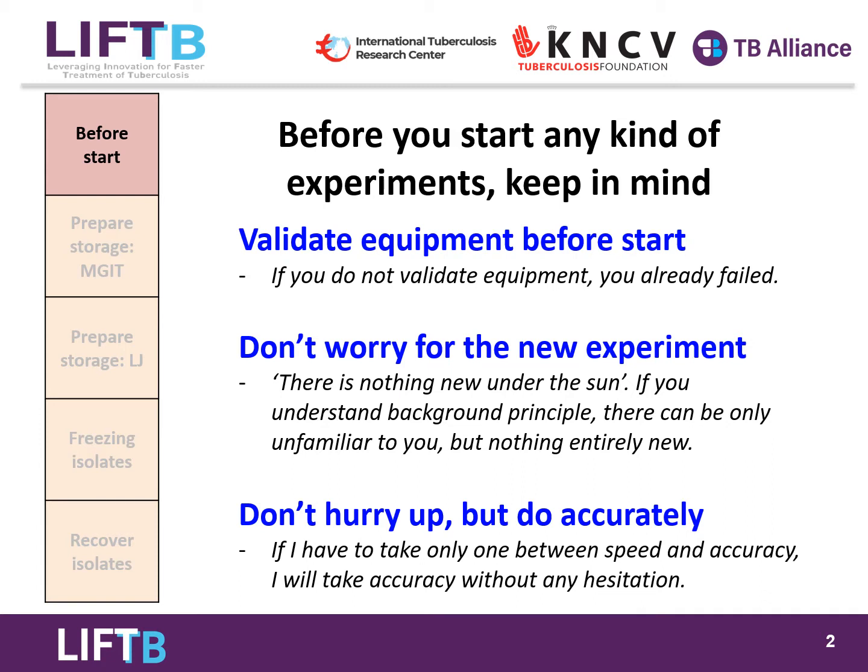Second, you do not need to be afraid of starting this new experiment. I understand that all participating countries have experience with bedaquiline pDST using the MGIT system. If you have completed this, you will note that pDST for linezolid and pretomanid is not that different from pDST for bedaquiline. The main difference is the drug substrate being evaluated. The principles, procedures, and other details are nearly identical.